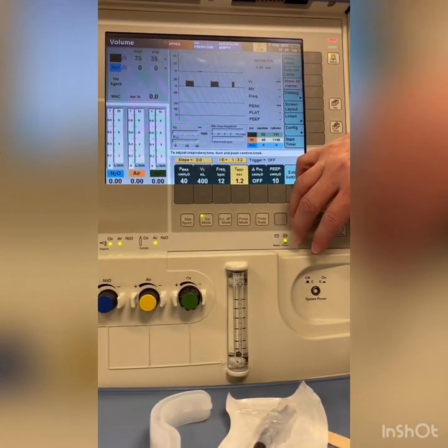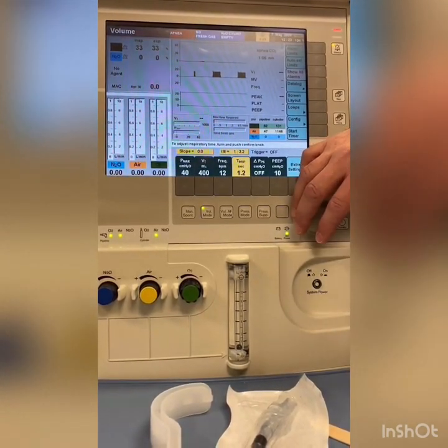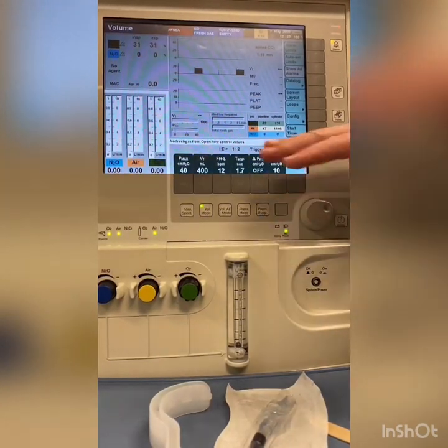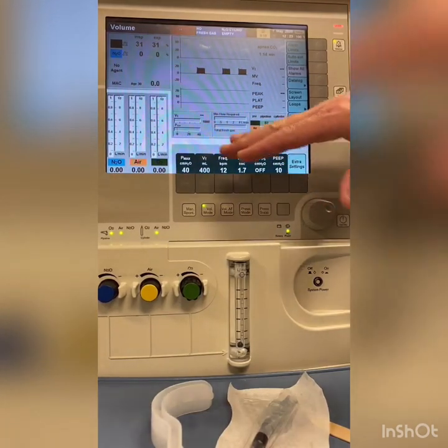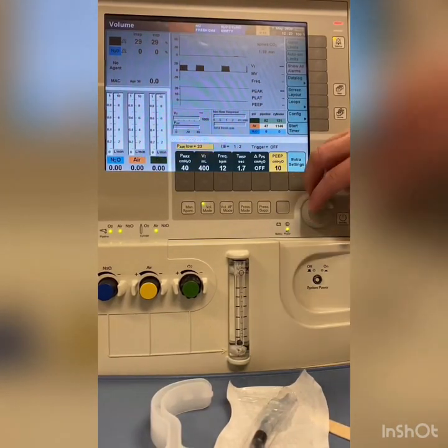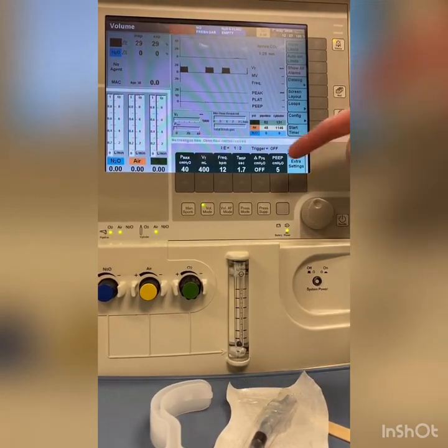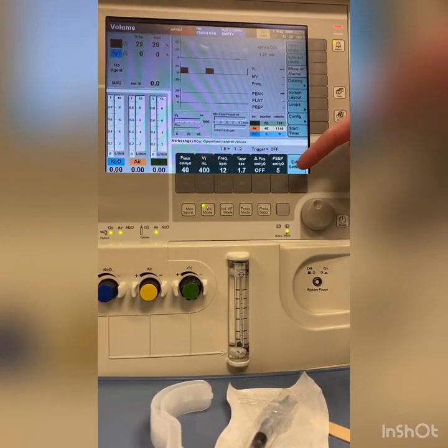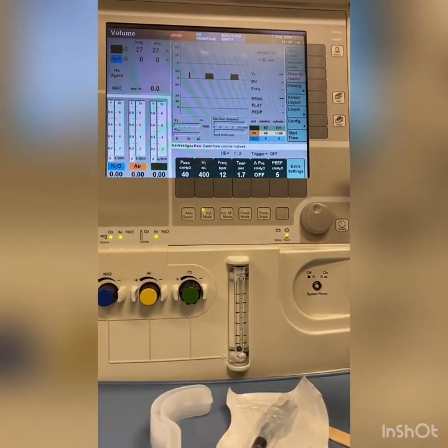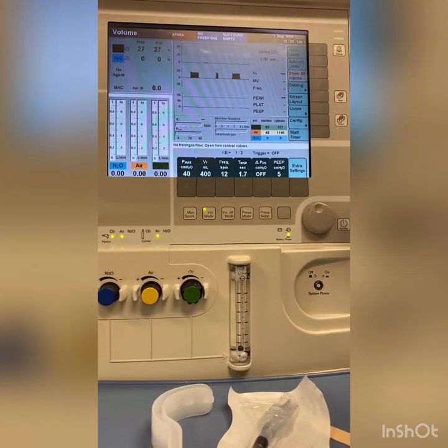You make all the adjustments based on the patient and their end-tidal CO2 and their peak airway pressures once you're on there, because you don't know how bad their COPD is or any of that process. So normal patient, ASA 1, I'm going to leave it at 1 to 2. PEEP, I want you minimally to always have at least 5 of PEEP on your patient. You can have 10, but I want you to have minimally physiologic PEEP, which is 5 centimeters of water. And this is how I would set up how I'm going to start my ventilator.